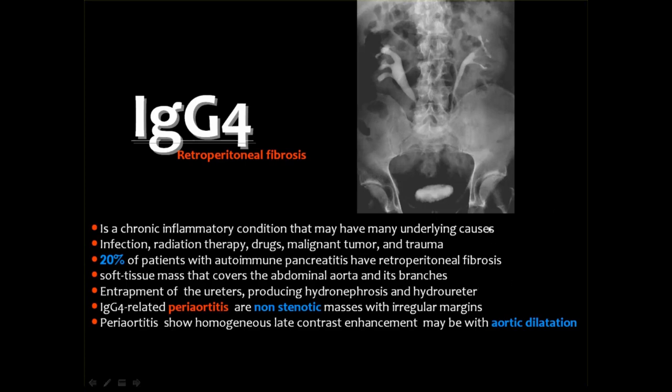And in the era before CT and MRI, we used to diagnose retroperitoneal fibrosis whenever you see on the IVU film that the ureters are medially displaced, and there are some back pressure changes in one or both of the kidneys.